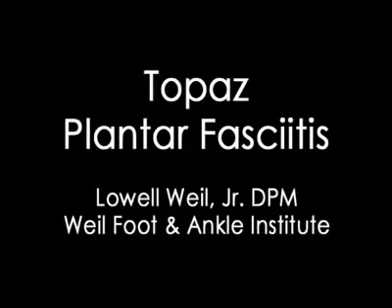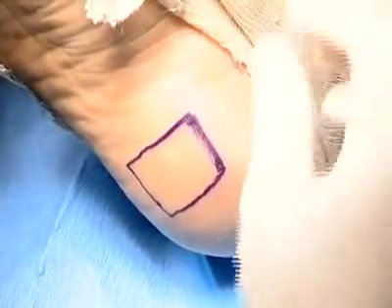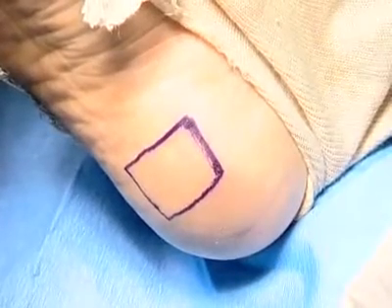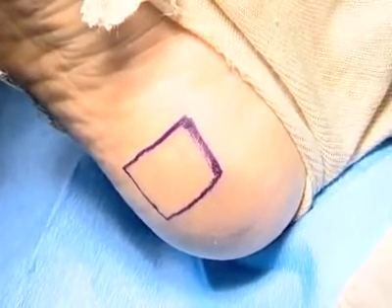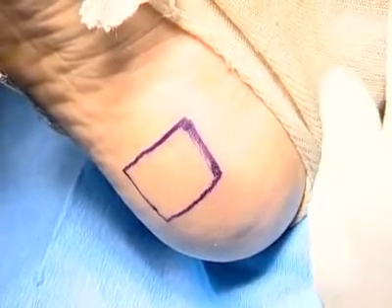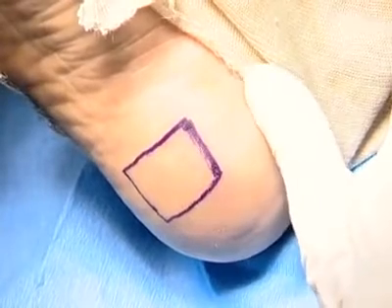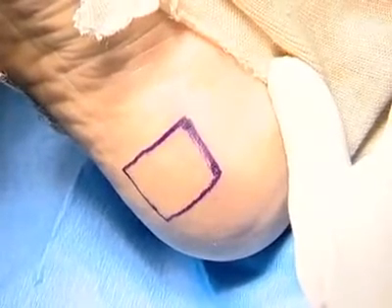Percutaneous Topaz for the treatment of chronic plantar fascia, a new technique. This patient has suffered from chronic plantar fasciitis for more than 6 months and has failed all conservative care. The patient wishes to undergo a more aggressive surgical treatment to try to eliminate their chronic plantar fasciitis.